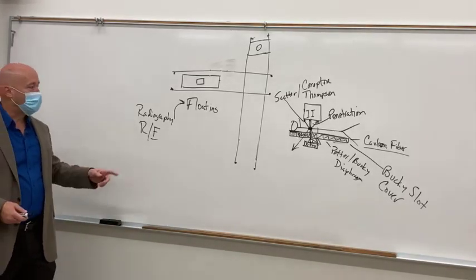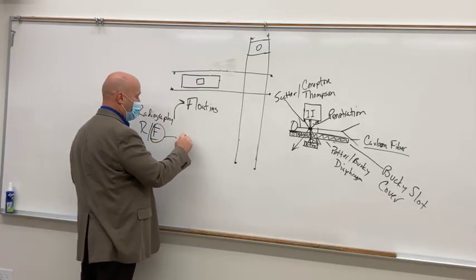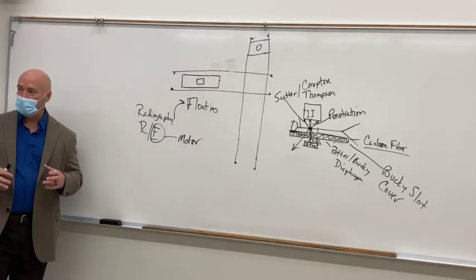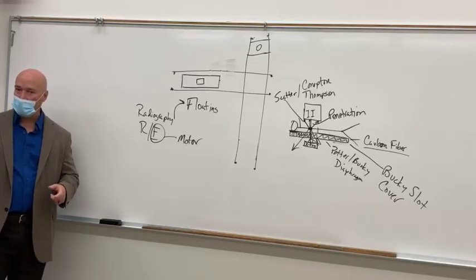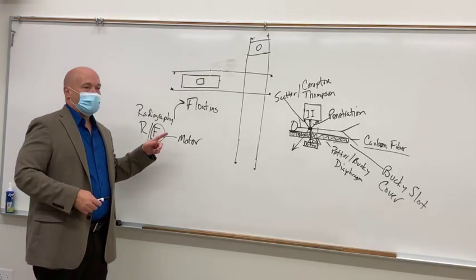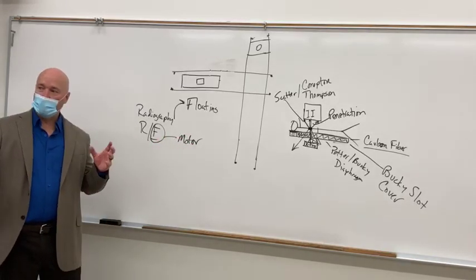The other type though are motor driven, and a fluoroscopy unit is usually motor driven. The motor driven gives you a little bit more precision in your movement. You don't have to eyeball quite so much. You can just kind of bump the patient in different directions until you get them to where they need to be. But at the same time, they provide more stability for fluoro units.